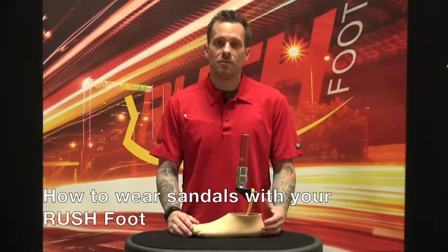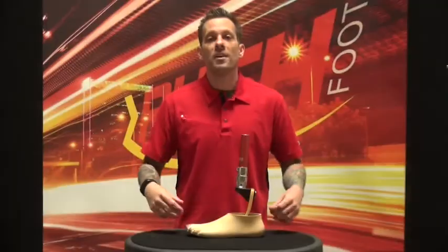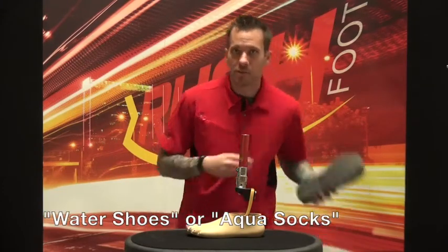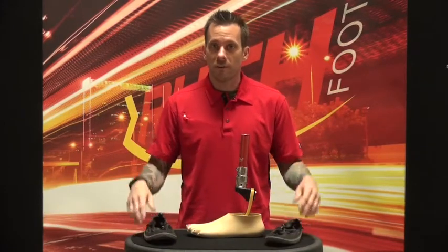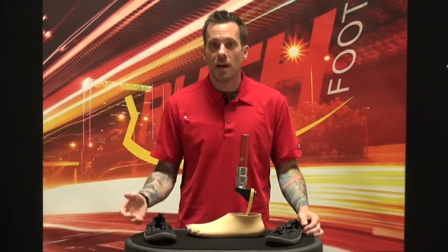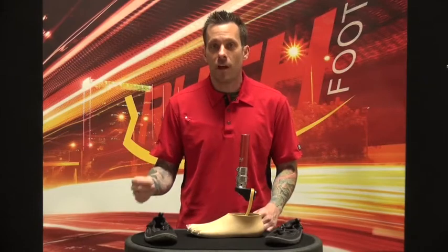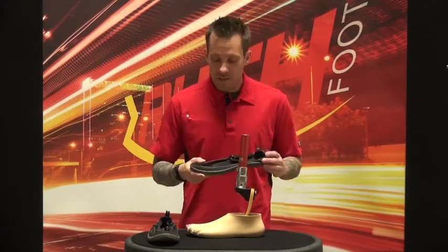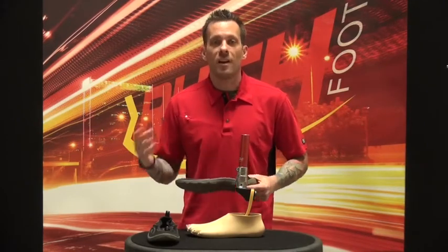In the past we've done videos about how to take sandals and modify them so that they will stay stuck to your prosthetic foot. When I go to the pool or the beach, I want just a little bit more protection, so my choice is water shoes or aqua socks. You can find these at just about any big retail store, especially around this time of year, or you can search online for water shoes or aqua socks and find tons of options. These give me plenty of grip and stability as well as protect my whole foot.